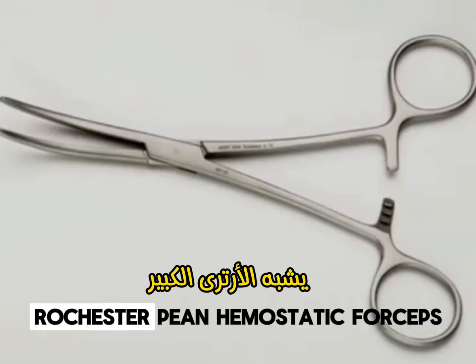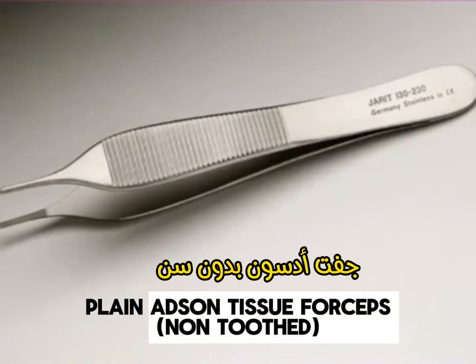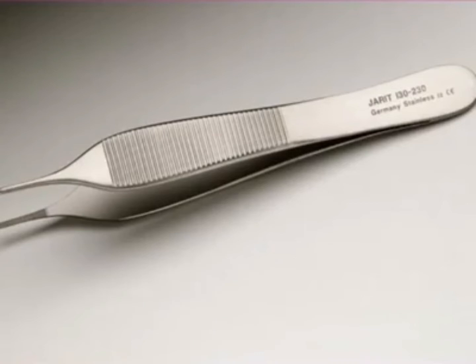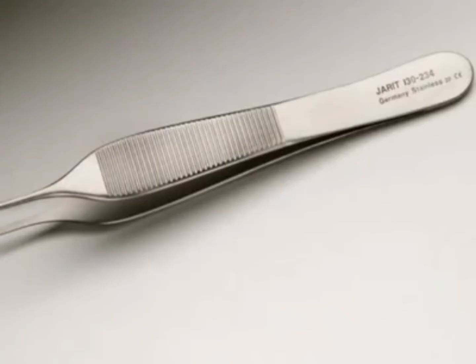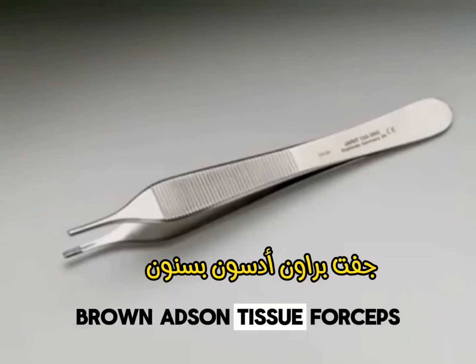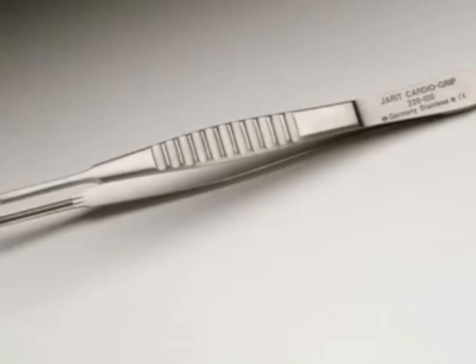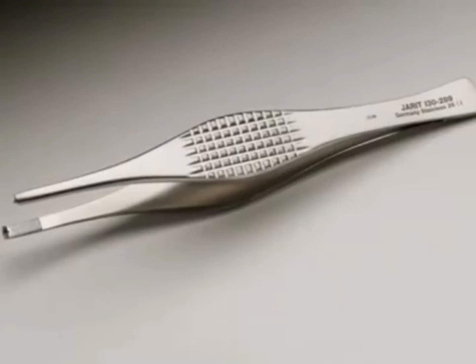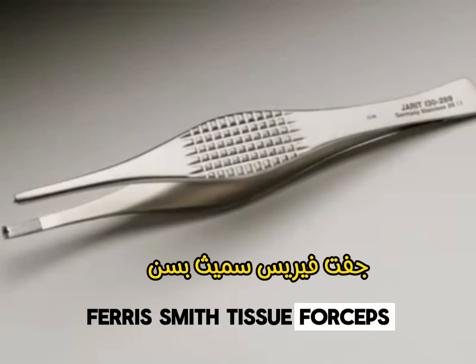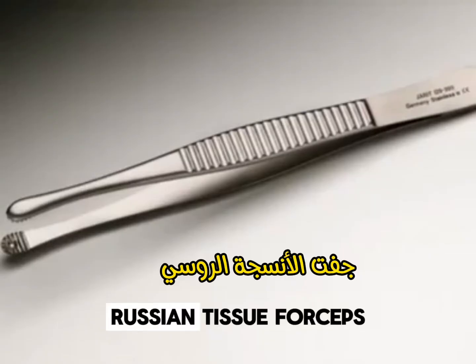Rochester Pian Hemostatic Forceps. Plain Adson Tissue Forceps. Toothed Adson Tissue Forceps. Brown Adson Tissue Forceps. DeBakey Tissue Forcep. Ferris Smith Tissue Forceps. Tissue Forceps.